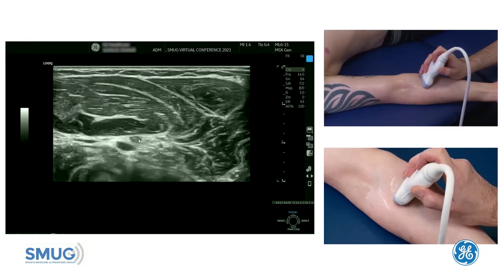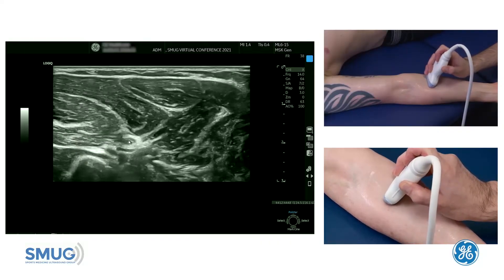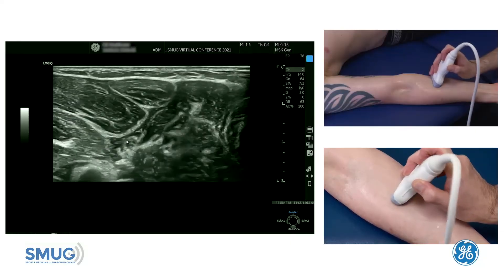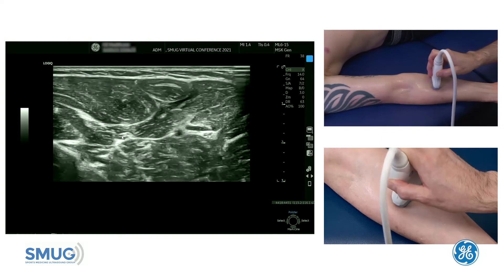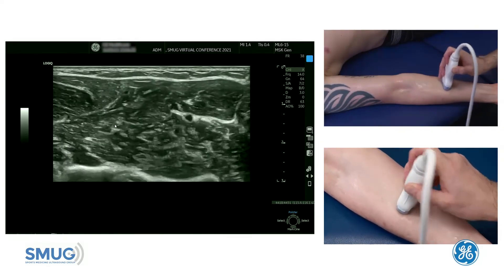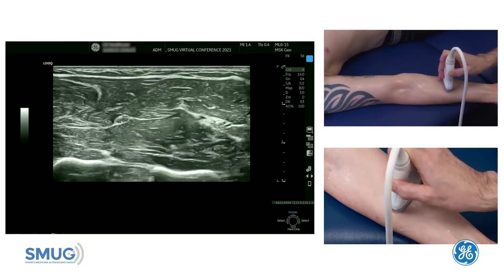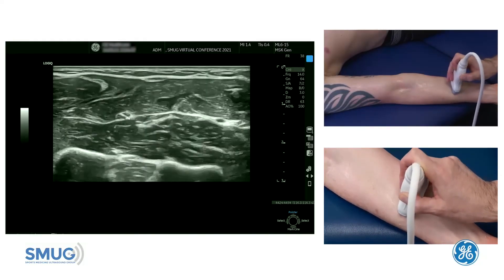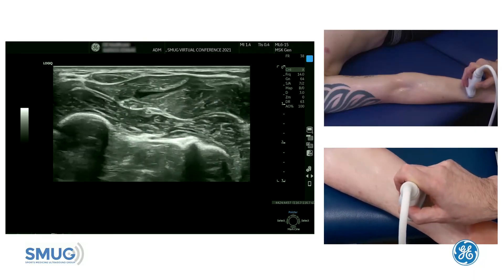You can see the fascial tissue as well as the nerve here, deep to the pronator. Now it comes out of that fascial plane again. At any point, stop for a moment and work to make sure you can see that internal echo of the nerve in detail, then keep following it further into the forearm. When it's not in the fascial plane you have to work it a bit harder if you want to make it stand out, because the muscle fibers around it make that a little bit more difficult. Here the fascial plane gets more pronounced and the nerve becomes a little easier to follow.